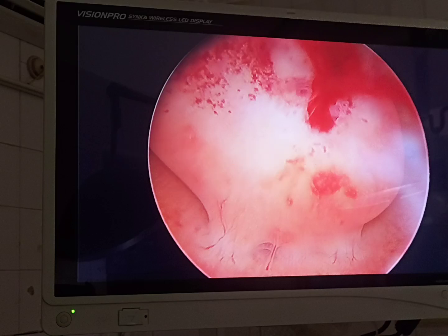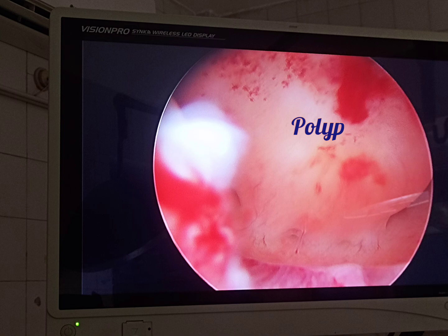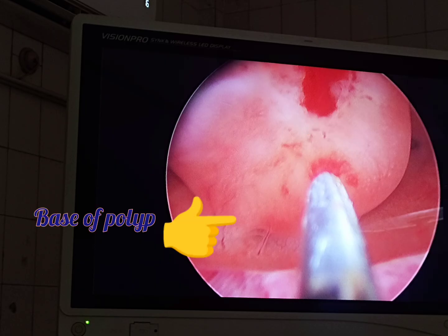Hello everyone, today I am going to discuss the procedure of hysteroscopic polypectomy. A multiparous middle-aged female came with the complaints of intermenstrual bleeding. On transvaginal scanning, a polyp was found.